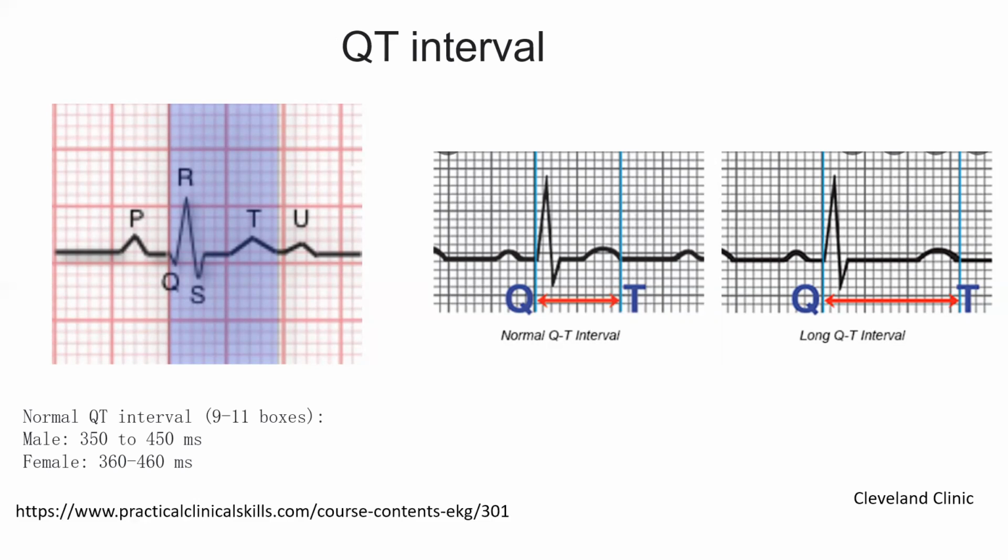If the patient has a long QT, the patient will tend to have ventricular tachycardia and fibrillation. That's actually a very threatening condition. So once the patient has a long QT, we really need to evaluate those risk factors, in case the EKG turns to VT or VF.